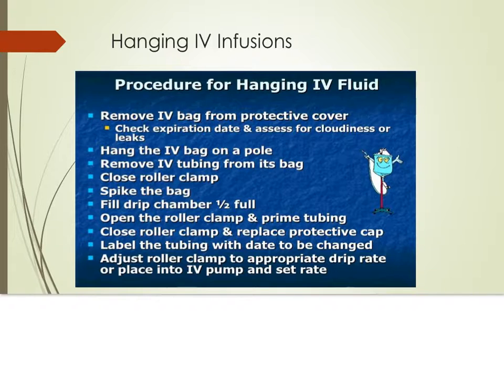Although we have already discussed hanging IV fluids in connection with initiating IV therapy, there are other times during the infusion therapy that hanging IV fluid also can occur. The same steps you use to prime the tubing that we discussed in the last unit are used when it is time for a tubing change. In addition, if the patient's IV site has a saline lock and no fluids have been infusing, the saline lock will need to be flushed prior to hanging new IV fluids. Remember, if fluids, flushes, or medications are being administered through a central line, placement must be confirmed with a chest x-ray prior to the first use of the central line.